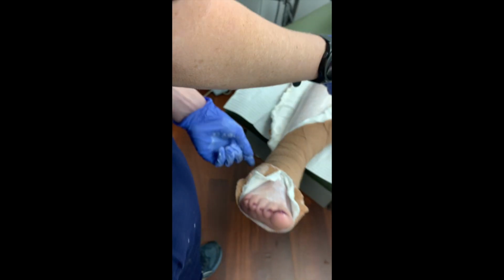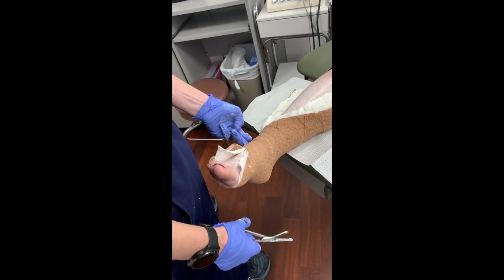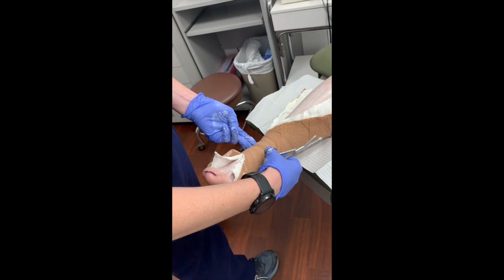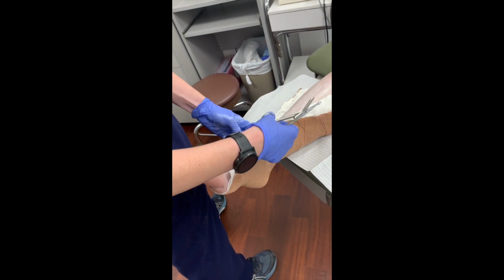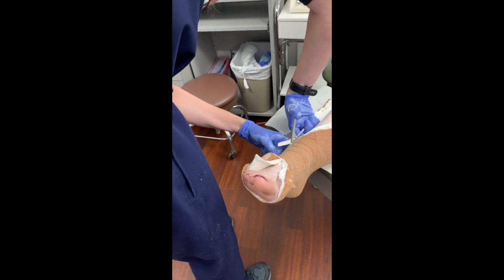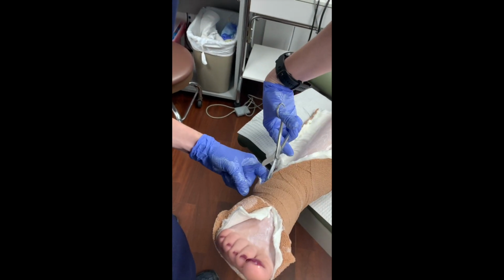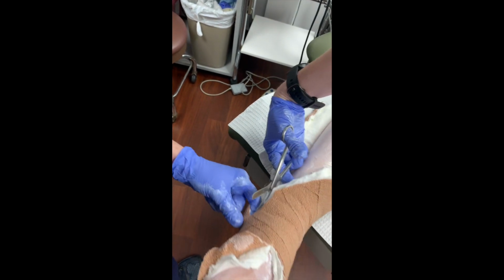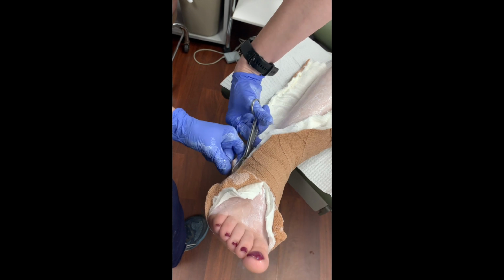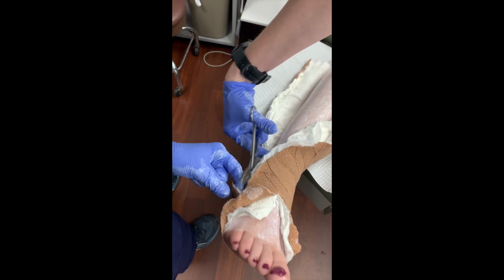And then when you get down to the ankle, you have your medial malleolus here and your lateral malleolus here. You don't want to cut right over those either, just because the anatomy of those areas can be a little bit difficult to get around. So be mindful of that. When you feel that, be extra careful to pull up the dressing and away from the skin. And then you can make the turn and go into the pedal or the foot compartment. Okay, there you go. Good.